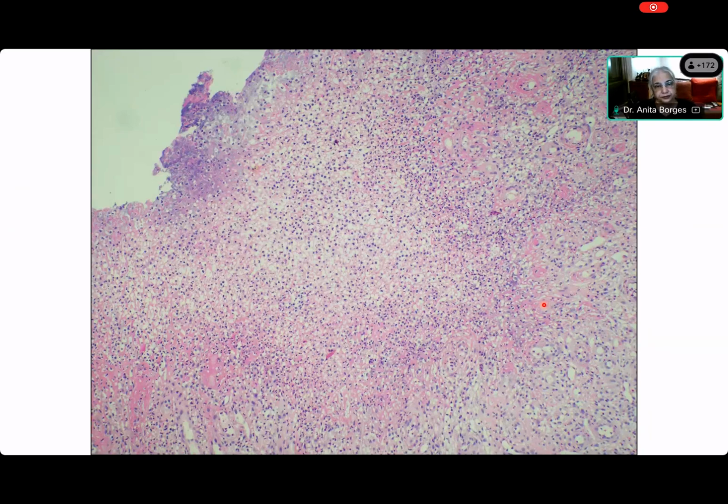Yes, ma'am. This is, ma'am, section shows surface ulceration, base of ulcer shows granulation tissue containing the. One minute. What is showing granulation tissue? The base of the ulcer. Can you show me where is the base of the ulcer, please, Deepali? Ask for annotation. Good. Now show me the base of the ulcer. Yes, ma'am. Take the pen, take a nice thick stick. And this is the base of ulcer.